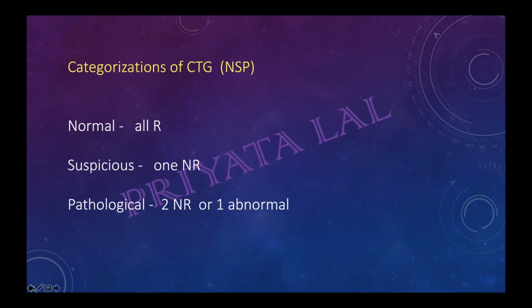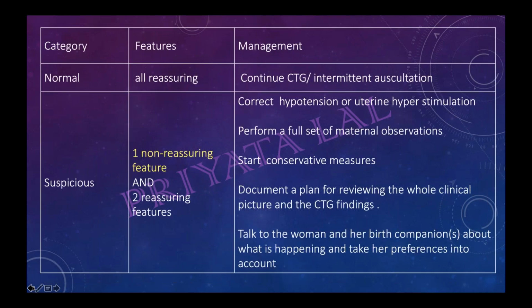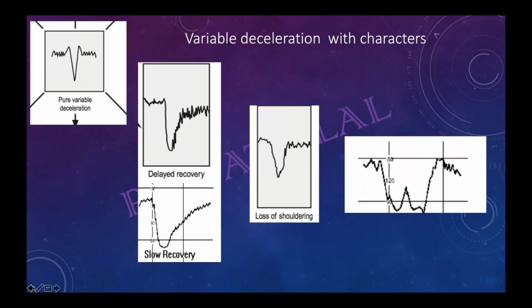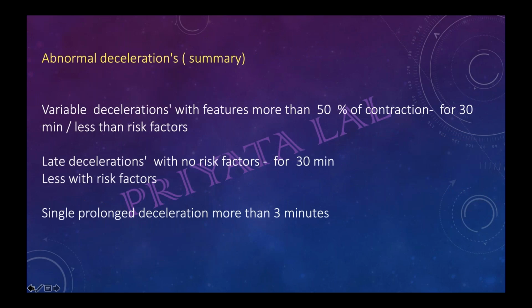Ma'am, what would be the baseline of the CTG which you showed right now? You have to wait. I will ask you. Who are you speaking? Sorry, ma'am, myself, Amita. I just couldn't know the baseline. Okay, I will tell you everything. There are so many traces. Now I'm just teaching. I will tell everything.